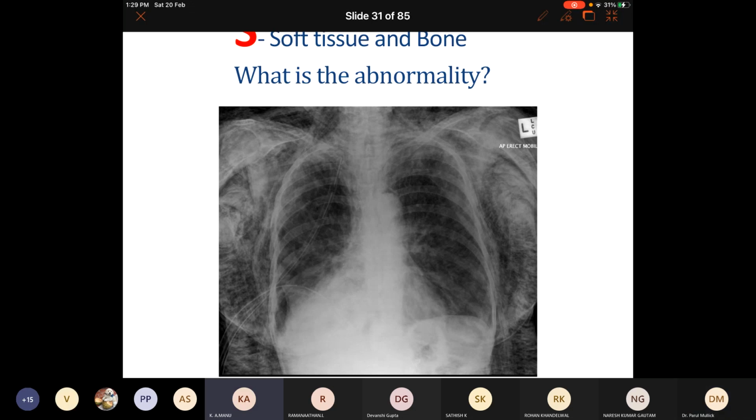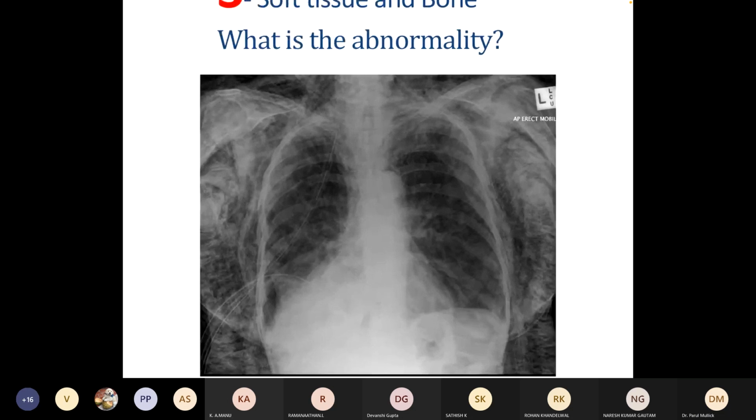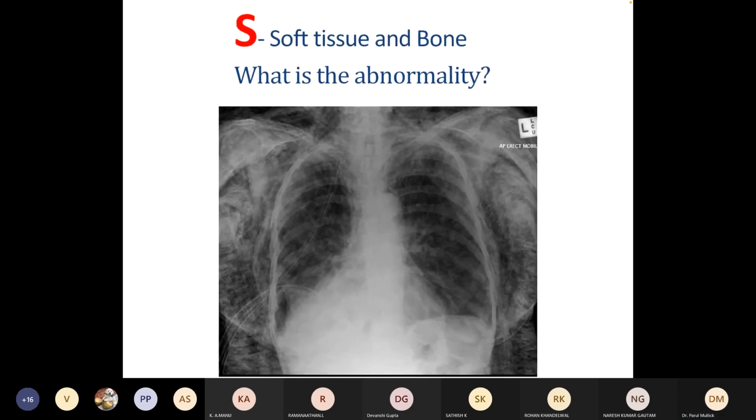Surgical emphysema. Excellent. Who is that? बेटा नाम बताओ ना, बिल्कुल ठीक आंसर बताया है. Who said that? Hello? Can you hear me? Yes, ma'am, we can hear you.